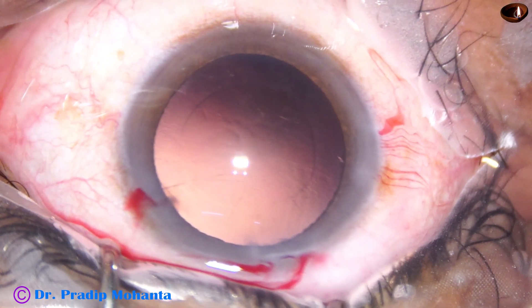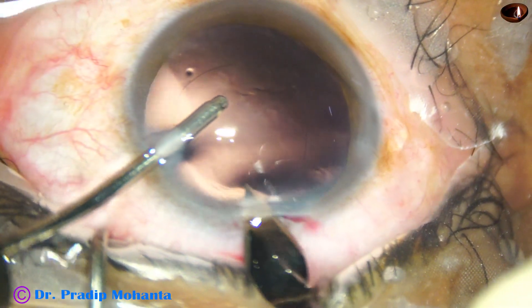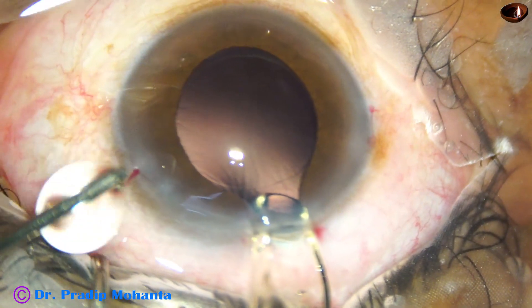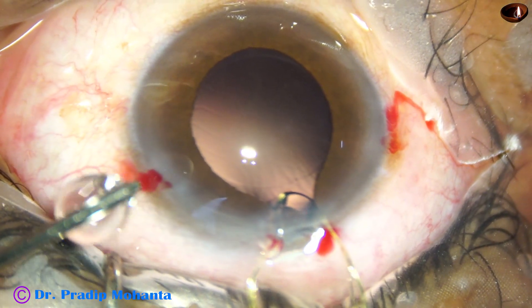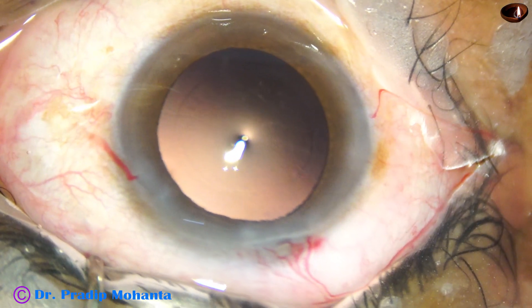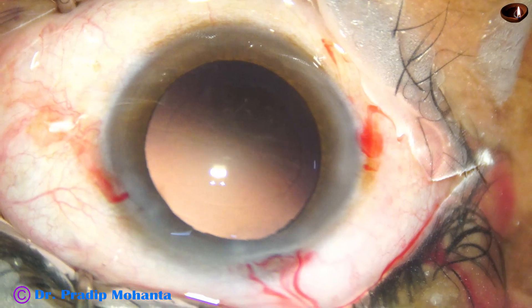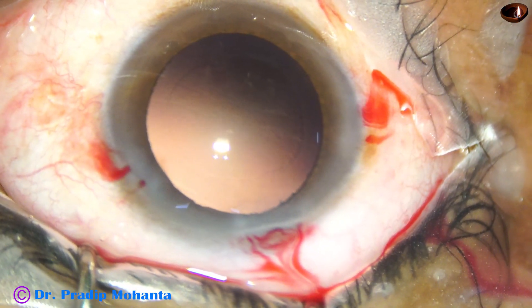Done. Now is the time to implant an intraocular lens. He is going to use a B cartridge, so he enlarges the main wound a bit — but it is not enough. The lens doesn't go; it is stuck. When you use a B cartridge, the wound has to be increased to about three millimeters. It was probably 2.9 and the lens got stuck in the wound as it came out. Actually, the tip of the B cartridge cannot be engaged properly if the wound is too small. So he is loading the lens again.